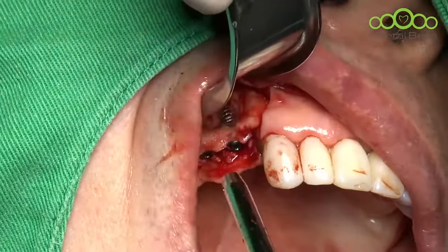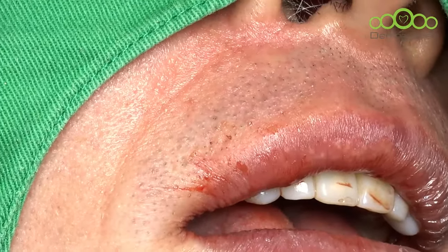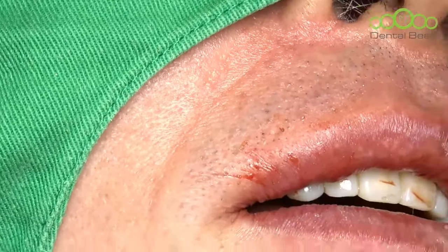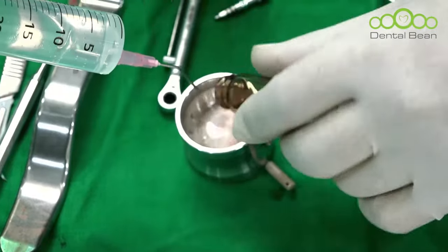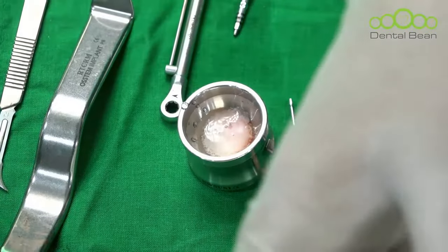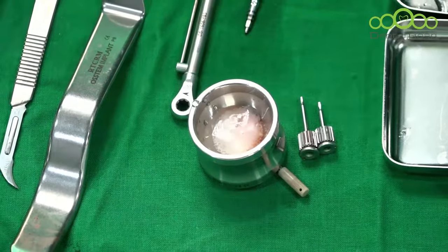Okay, first, membrane, bio cover. Lift it up, be careful, careful. Good. In such a case, we usually need a sandwich graft. 0.5, right. 10 seconds. I will use allogenic graft material inside, and then to preserve the volume, I will use xenograft, the porcine bone, at the outside. Okay.